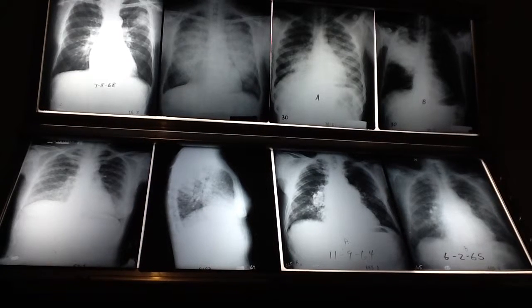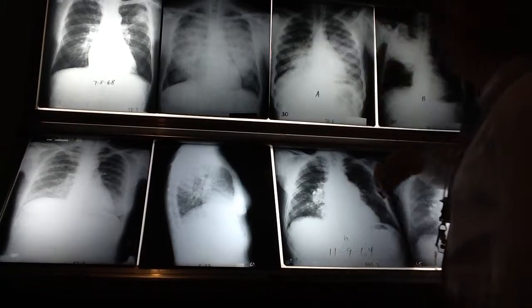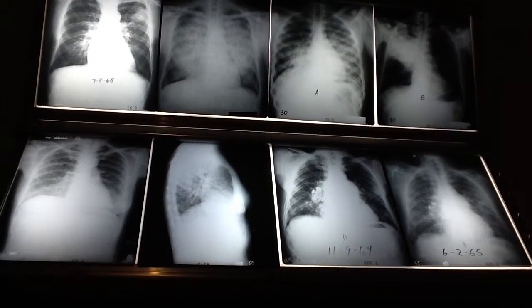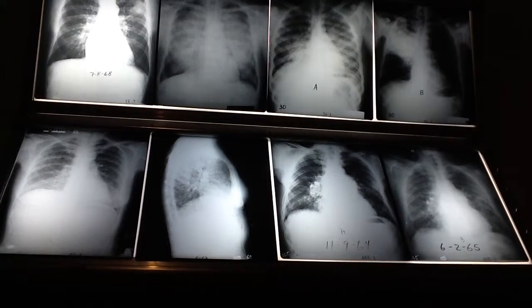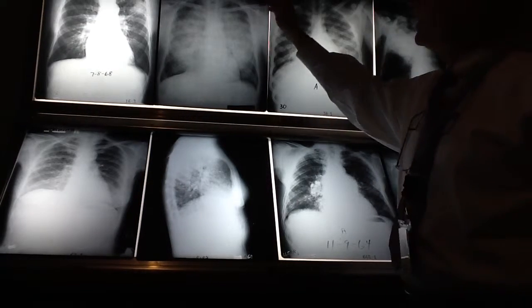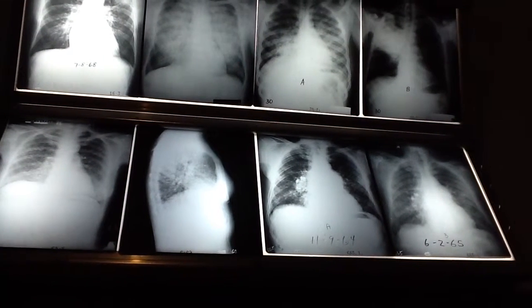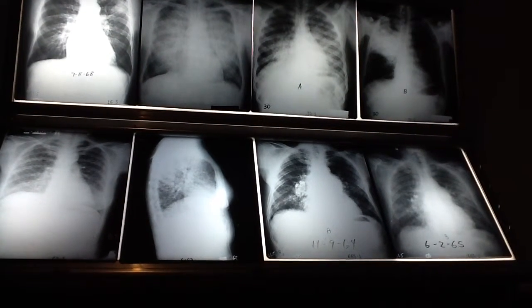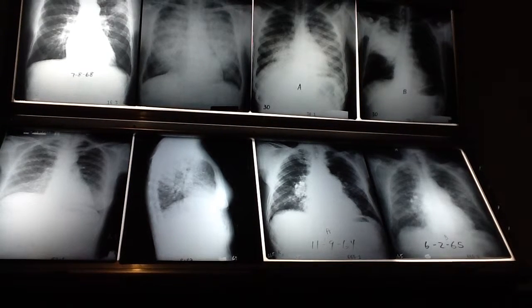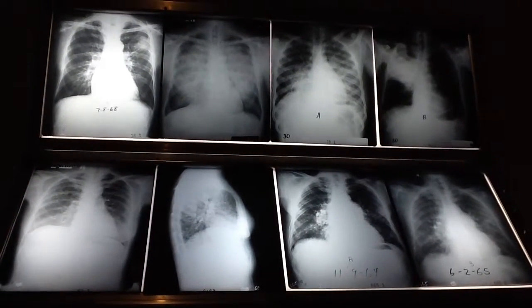Is this from like severe high blood pressure, like cor pulmonale kind of thing? Or what? No, mostly this is related to left heart issues and pulmonary venous hypertension. Most of the time. Because the butterfly shadow is a pulmonary edema pattern that's mostly related to cardiovascular issues. And it's typically left heart, like congestive failure, mitral stenosis, something compressing the veins in the mediastinum. The blood can't get out of the lungs fast enough, and the pressure goes up, which means the pressure also goes up in the capillaries, and it forces more fluid out of the capillaries.